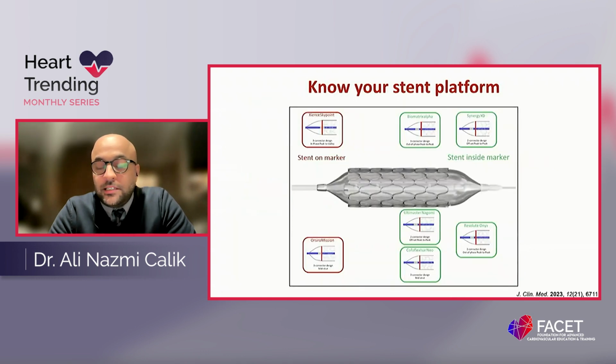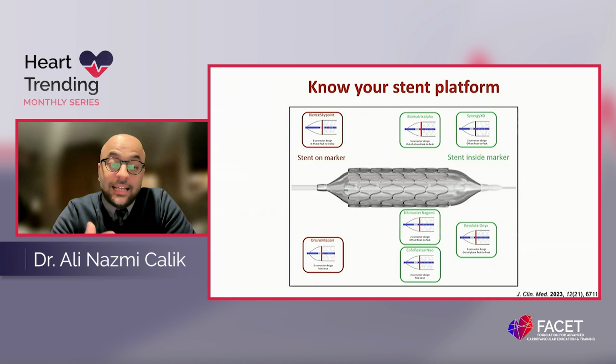Of course, all stents are different. We have to know our stent platforms. You see the relation between the radio-opaque markers and the metallic scaffold of the stent.